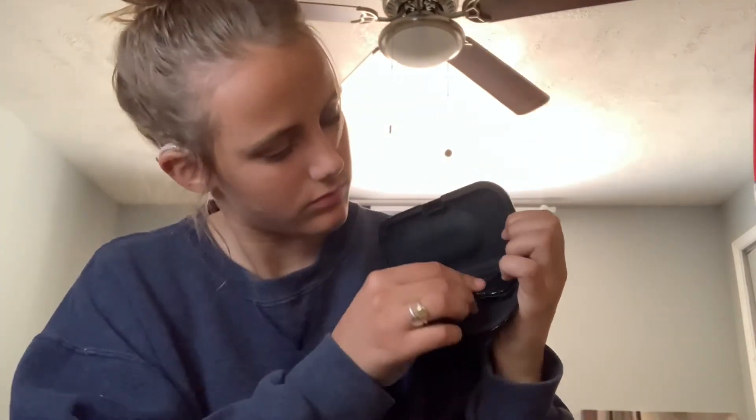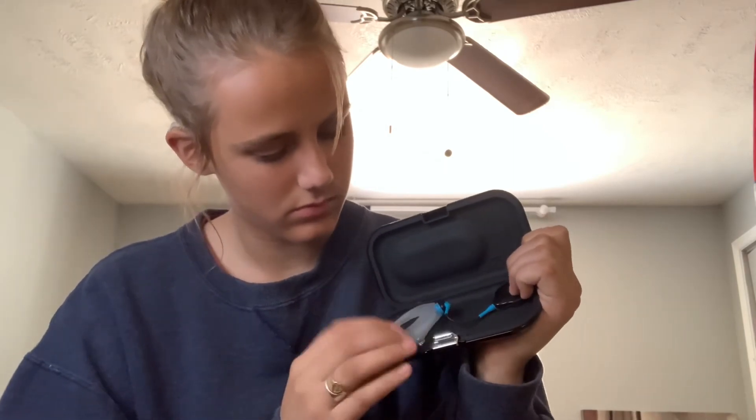I store it in this case which I got with my kit — it's really cute, I just put it in here and it fits perfectly, and I can bring it anywhere just thrown in my backpack. Compared to some cases it's a lot smaller and takes less space. I also store other things in here, like this accessory I use for athletics — if I want to jump or do things that might make my processor fall off, I might wear this.